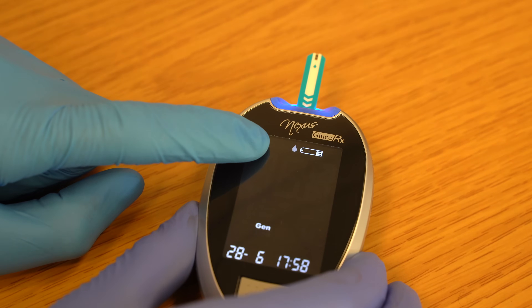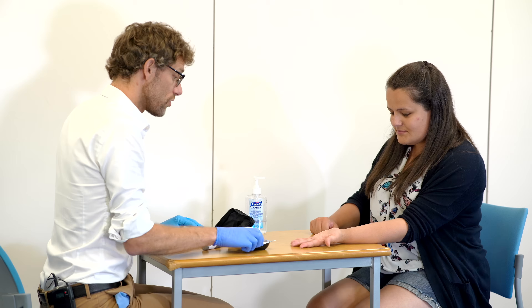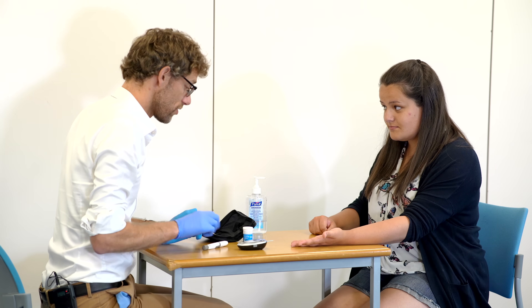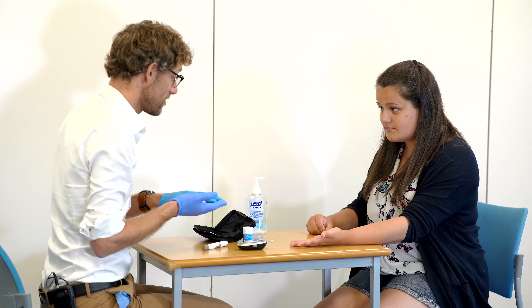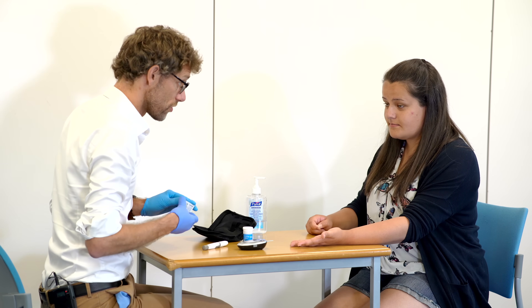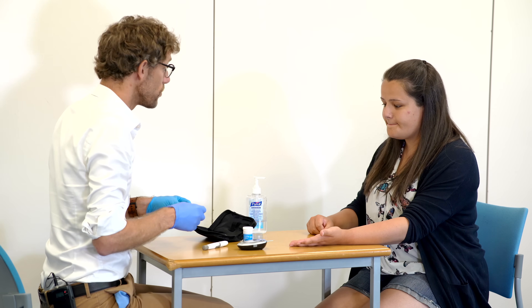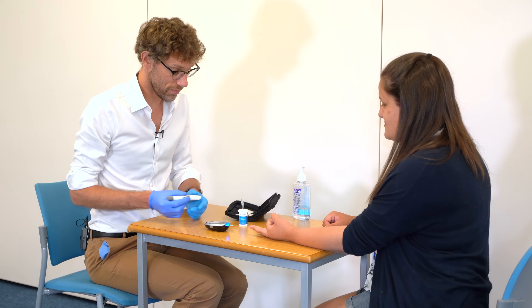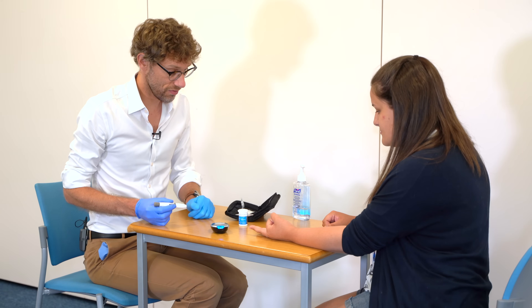Are you right or left-handed? I'm right-handed. So let's start off with your left hand. If we can just have your hand upwards like so. We'll go into the left side of your finger — it's vitally important to make sure that you don't take blood directly over the fingertip, because that's where all the sensitive parts of your finger are. Whilst a single shot won't cause a problem, over time that may actually cause damage to the skin and the nerves, which we don't want. We've got the needle in, set to four, and the prime is set.